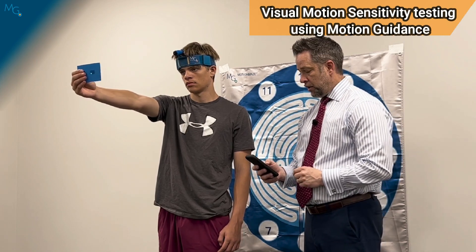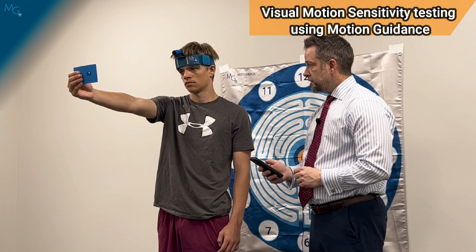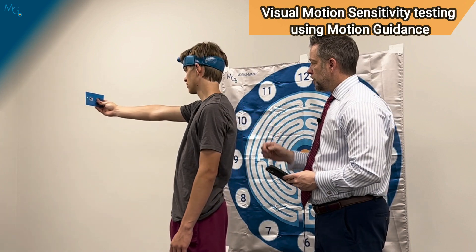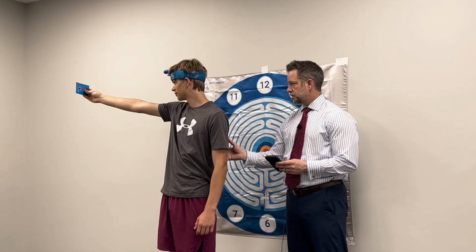The patient performs 10 full repetitions while keeping the laser on the card. So that's the speed. Go ahead and turn all the way to the right, and this is your starting point. Whenever you're comfortable, come all the way to the left.